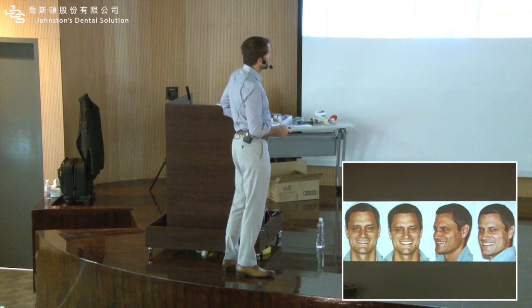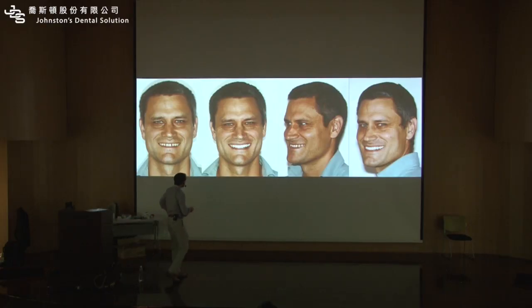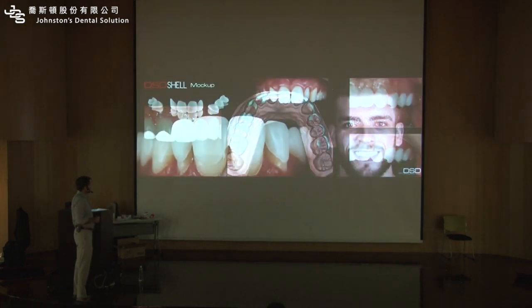Okay? So look how nice here. You have the black marker there, you see, you cannot even see. And you have pink composite here, here, there. So the mock-up, pink composite, and the black marker. And you can do magic. 5-10 minutes, picture, before and after, show to the patient, wow. Then you sit down, and then you explain. That's the strategy to value.